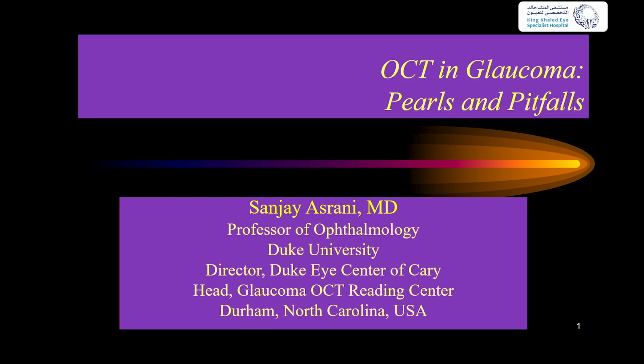There is no difference. The only correlation is refractive error. The problem is somebody has inserted a bug in the FDA people's heads that it is race related. And therefore, every machine is now required to get a race-based normative database, which is a total waste of resources. It would be lovely if there could be high myope, high hyperope thicknesses, and now high myope normative databases are coming out.